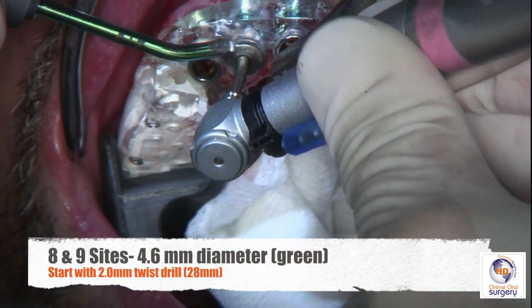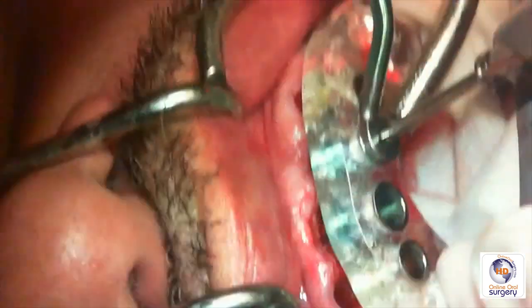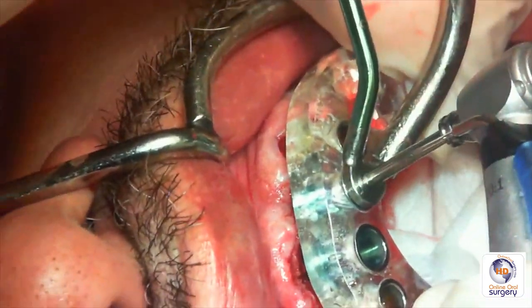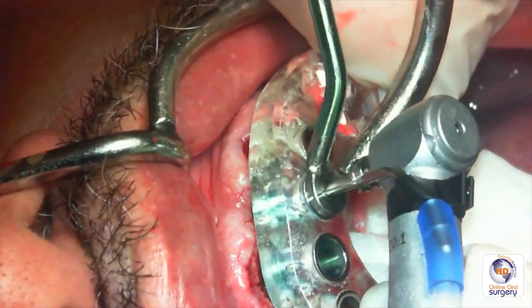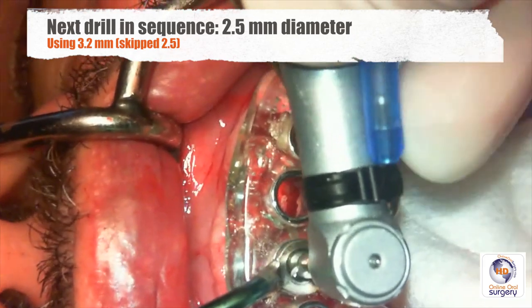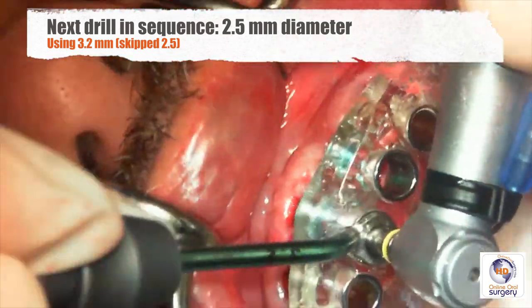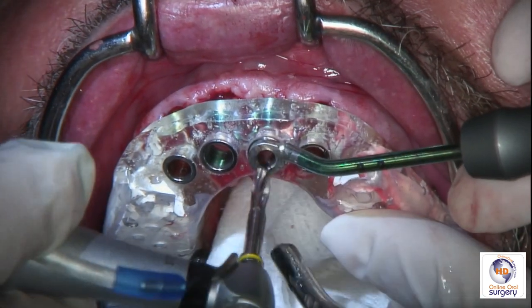And then we're going to prepare the number 8 and 9 sites. We're going to start again with a 2.0 twist drill, go all the way to depth. Again, this is going to be 28 millimeters in length, or the drill length per our protocol. Again, short light strokes going all the way to depth. Now, normally the next drill in sequence is a 2.5 millimeter, but we're going to skip that and go directly to the 3.2.